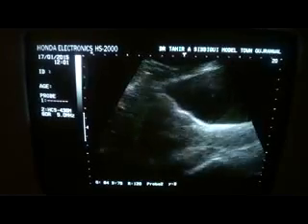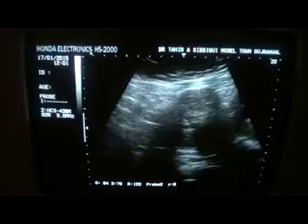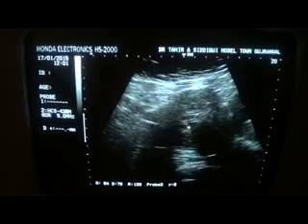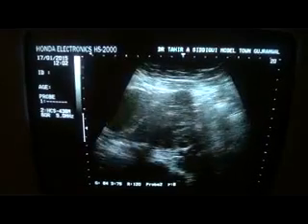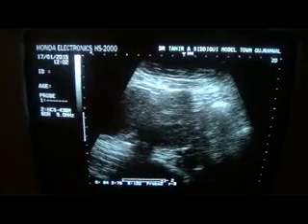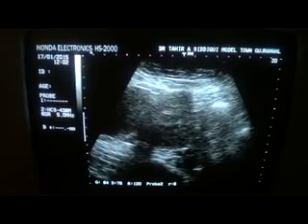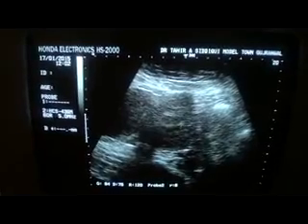with the largest one seen in the anterior wall. This is the largest one. This is the sac. See, when I give a sweep to the probe, it does not change its shape. It retains its shape, and this is the sac. So this is a case of uterine fibroid with threatened abortion, with the incomplete abortion. Thank you very much.